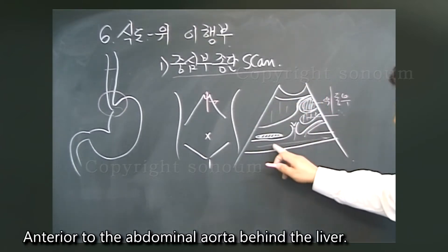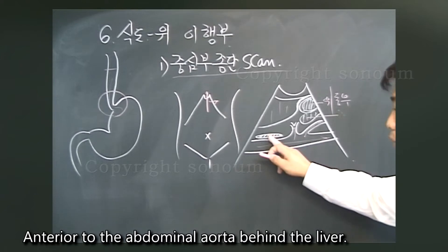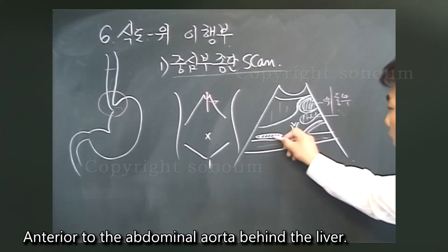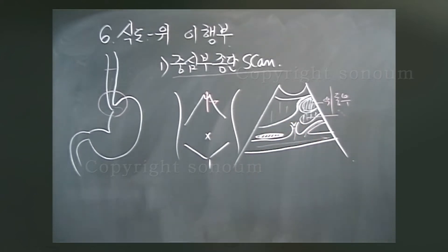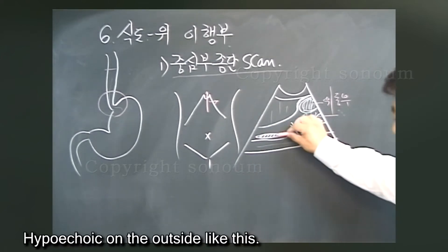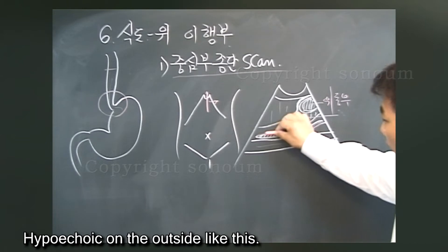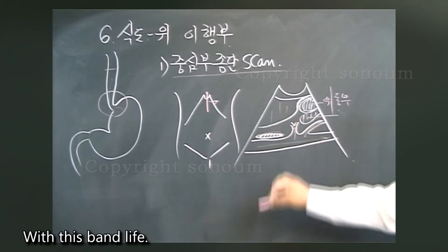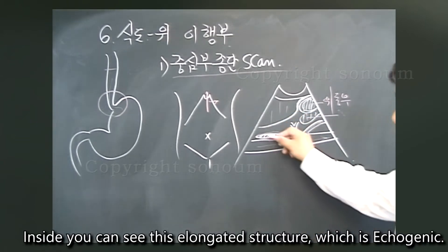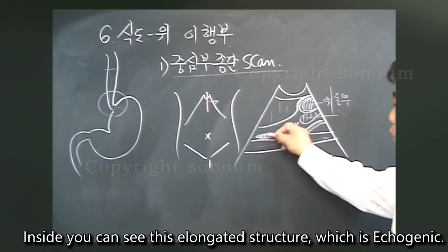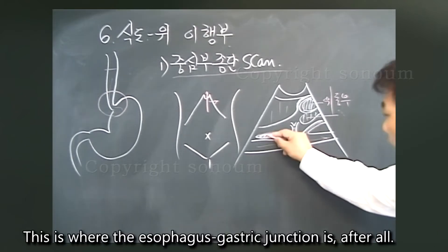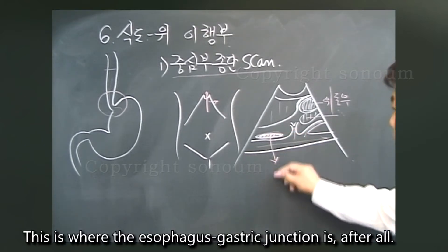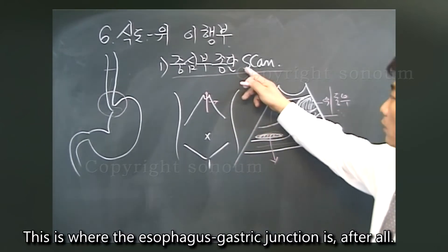Anterior to the abdominal aorta, behind the liver, there is a hypoechoic band on the outside. Inside you can see this elongated structure, which is echogenic. This is where the esophagus-gastric junction is.